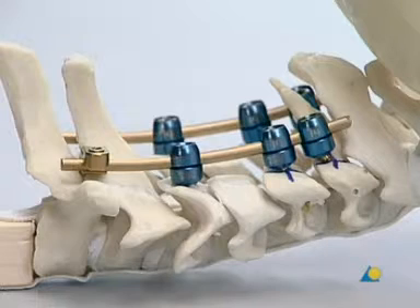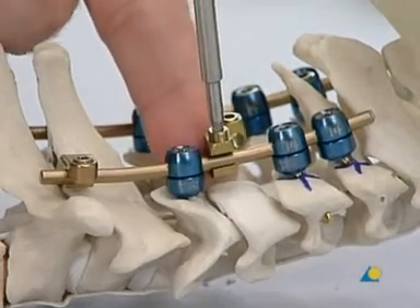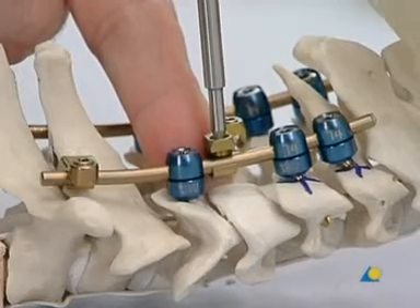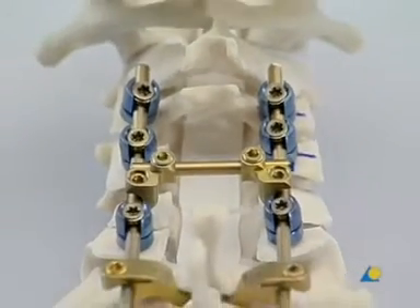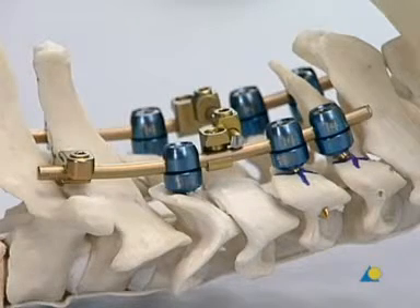If required, a lamina substitute can be mounted for fixation of the musculature and protection of the dura. For this purpose, a laminate clamp is mounted on each side and provisionally stabilized using the hexagonal screwdriver. A rod cut to the appropriate length is then introduced through both clamps and the set screws are tightened. The construct is now complete. Usually bone graft would be placed under and around the rod to provide a solid fusion mass.